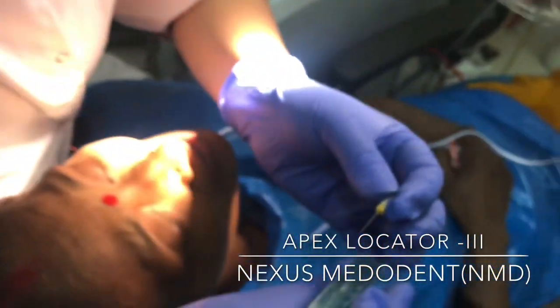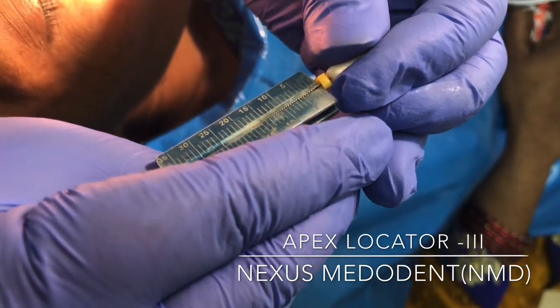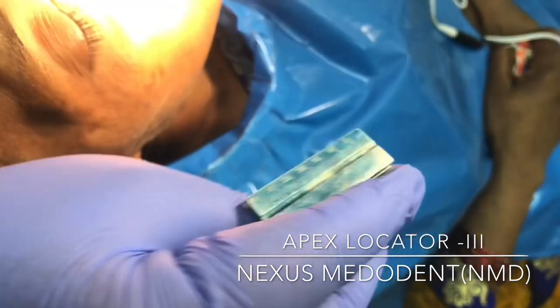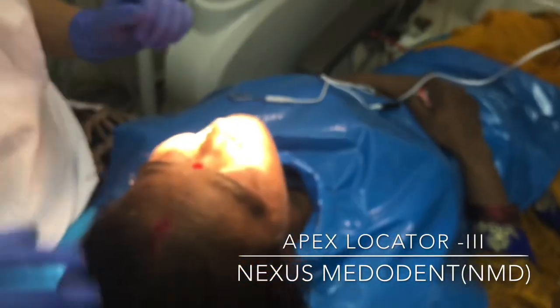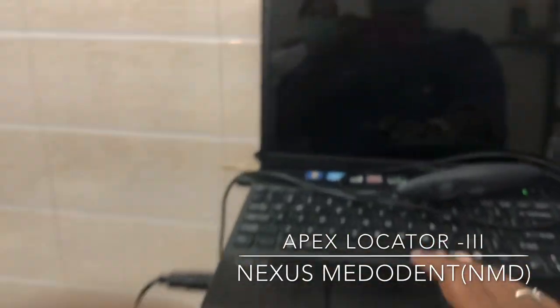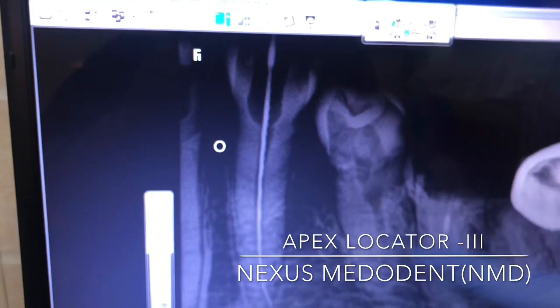So you can see it's giving me 18. And I've already taken the x-ray also, so you can see it's giving me the exact reading.